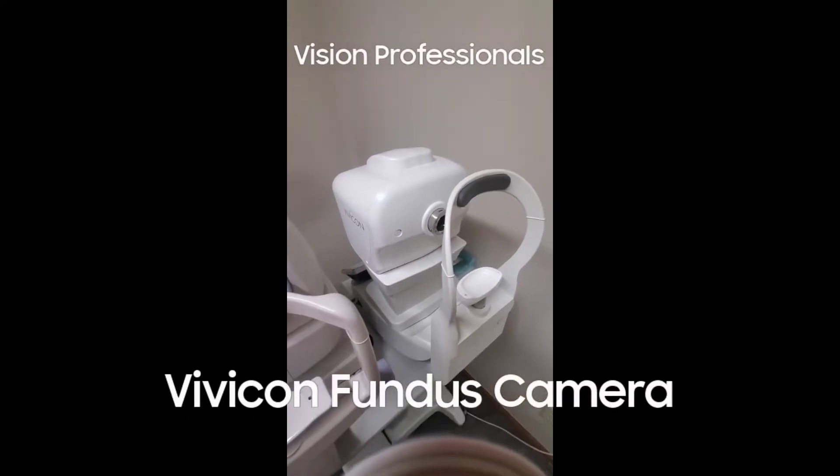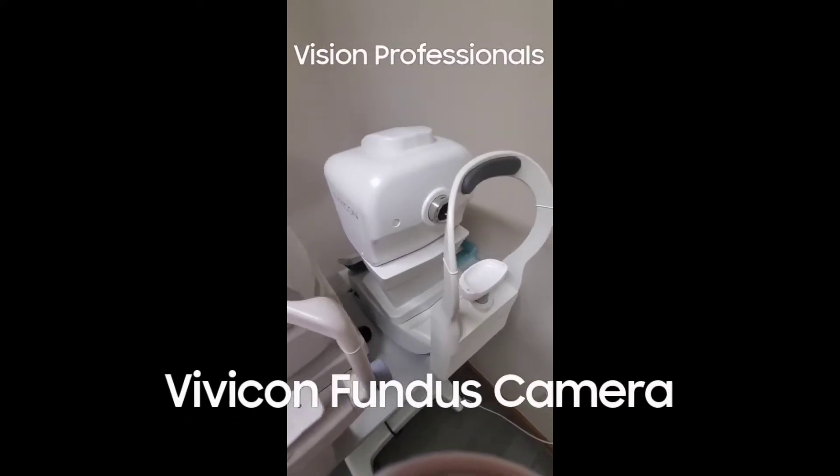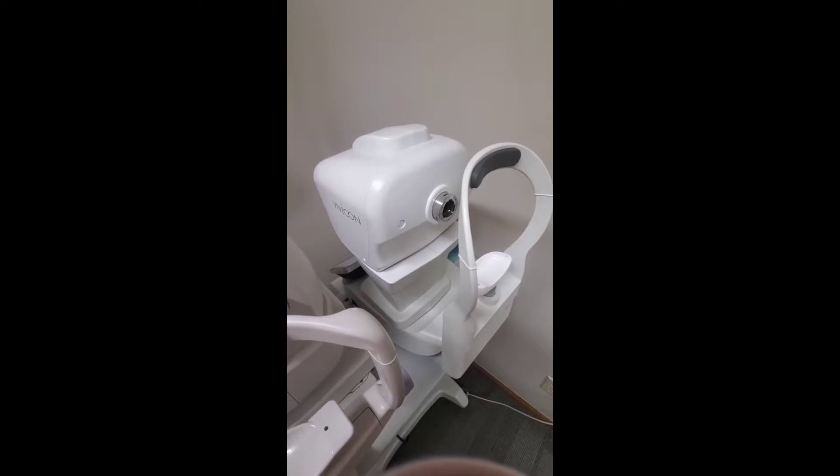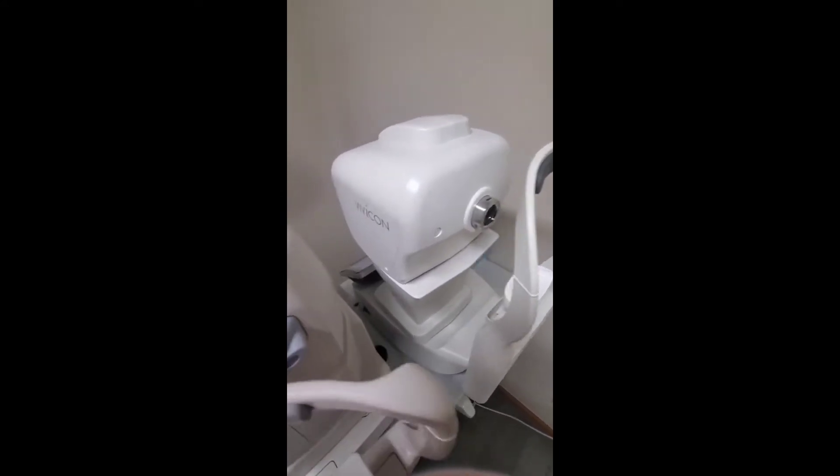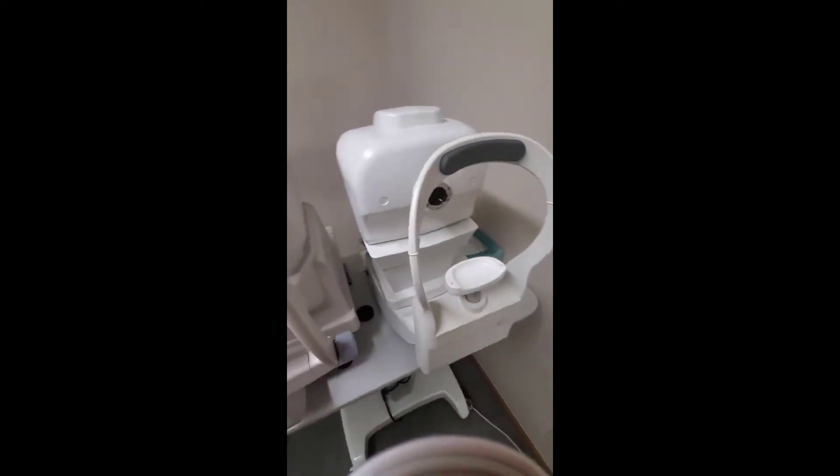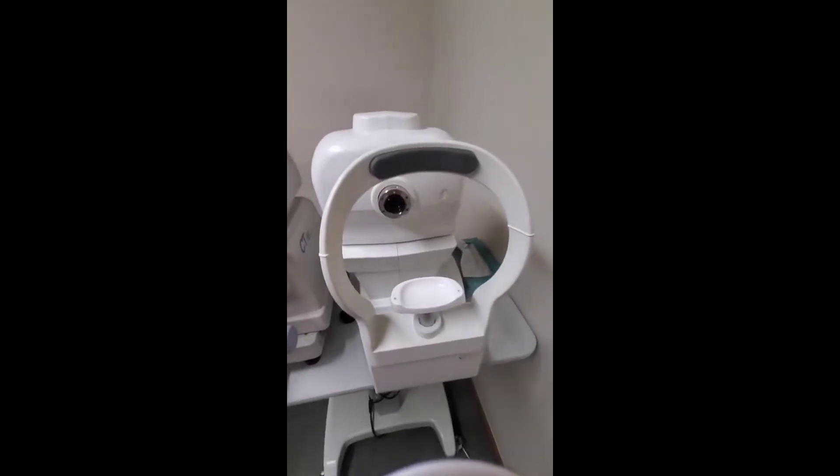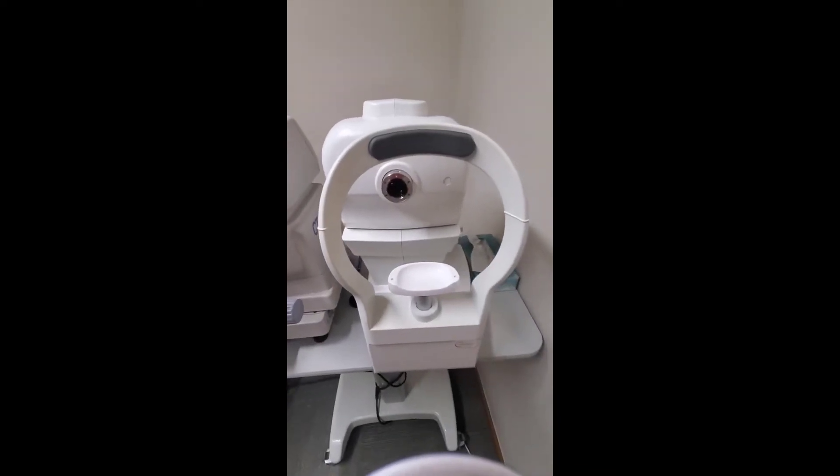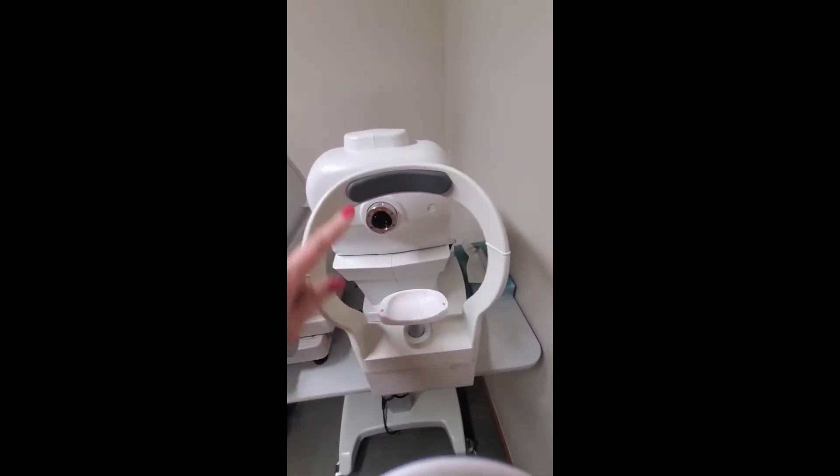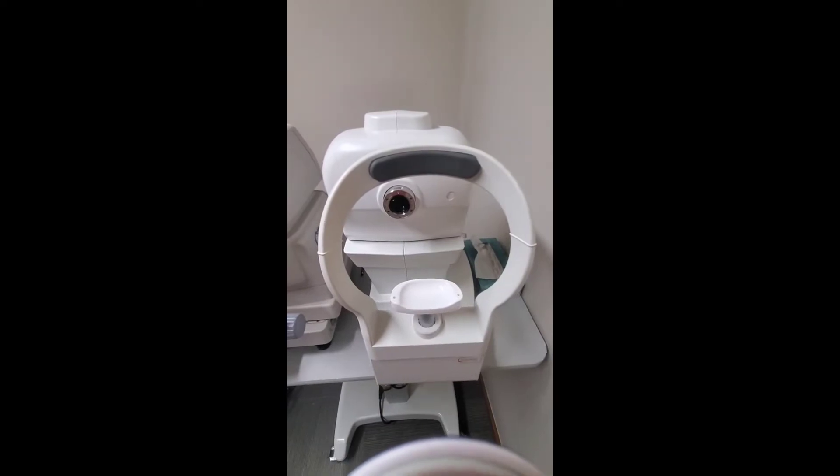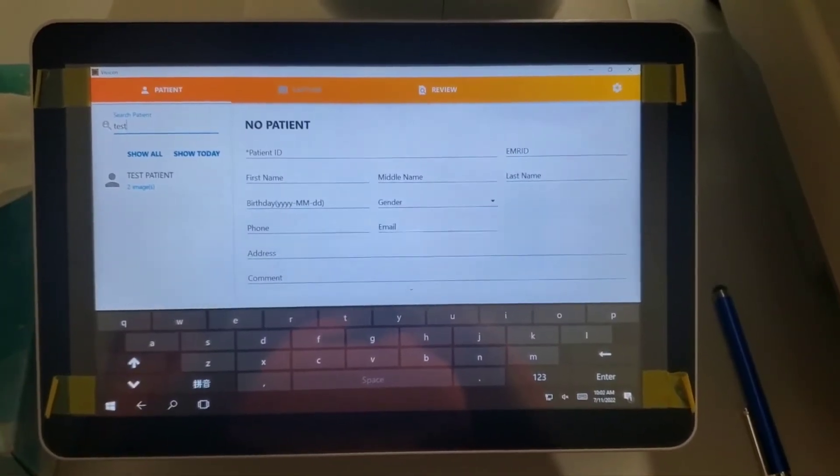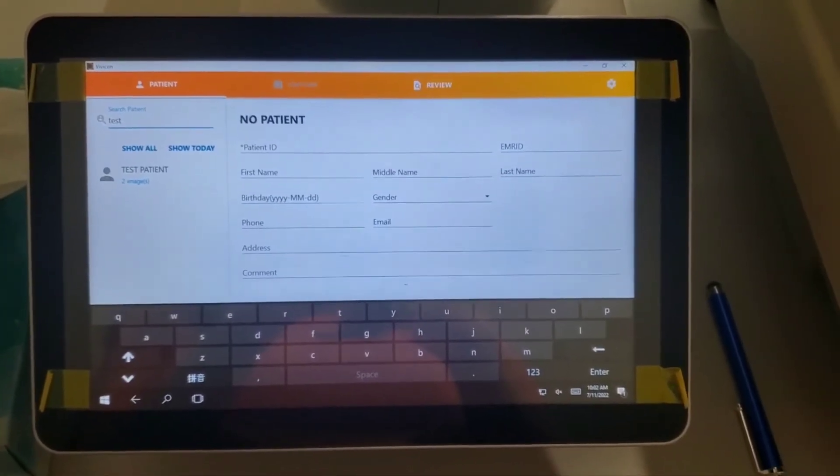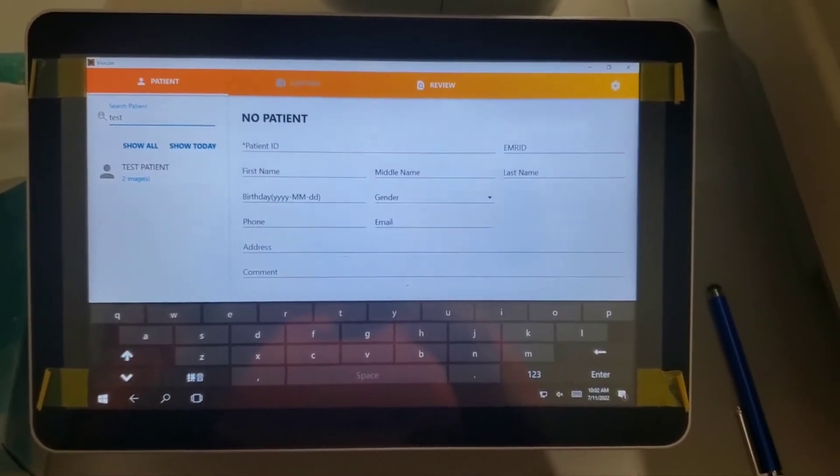Hello, it's Dr. Rock here. In this video we're going to go over the OptiView Vivicon Fundus camera. This is the side where the patient puts their chin and forehead. This is the other side of the camera. This is where we're going to enter our patient's information.